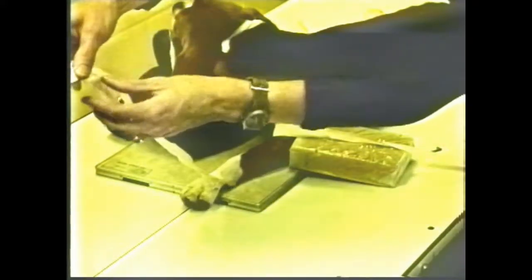The leg is measured and the beam can be centered either on the elbow area or the antebrachium depending upon the interest. If the elbow is the prime interest, it is a good activity to flex it so that you can be sure of the location of the elbow area.